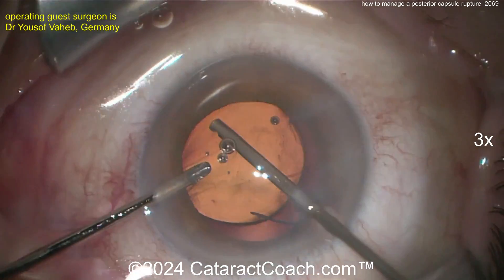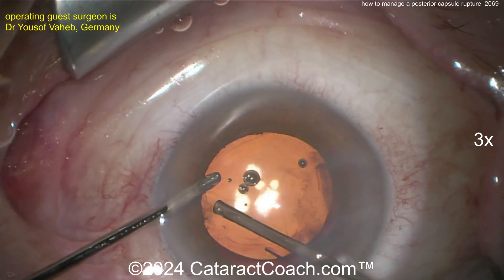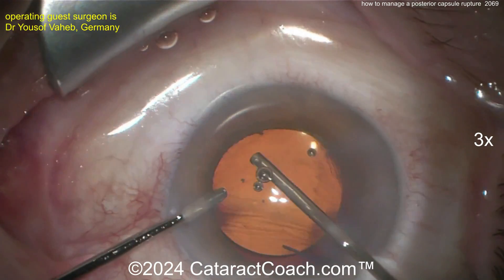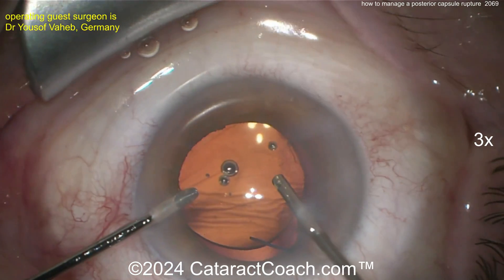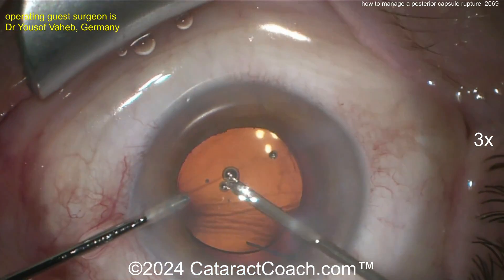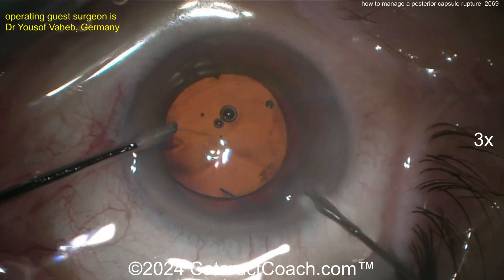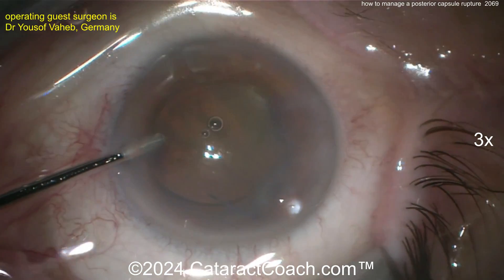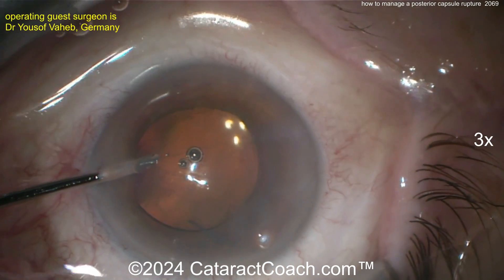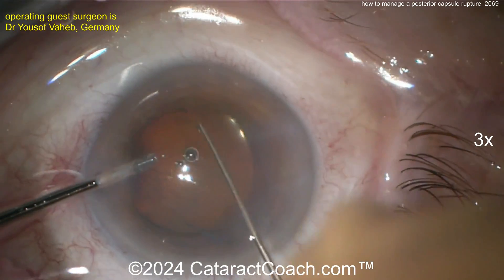The vitrector is very helpful here to remove any viscoelastic and any more prolapsed vitreous. You may also want to bring the pupil down with a miotic agent to make sure there are no more residual vitreous strands. Triamcinolone is helpful here — remember it also helps quell inflammation. There we go — triamcinolone beautifully done, and you now have no vitreous in the anterior segment.